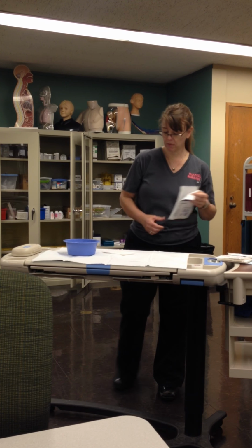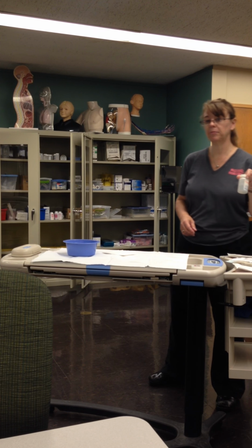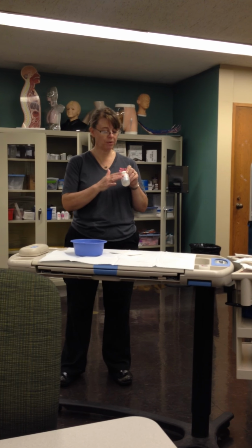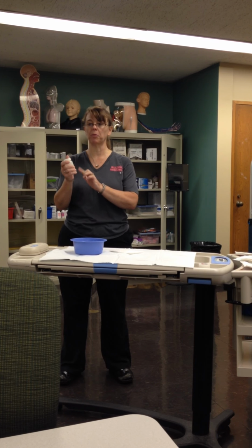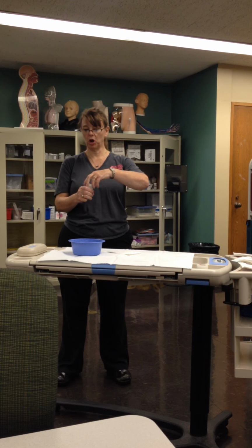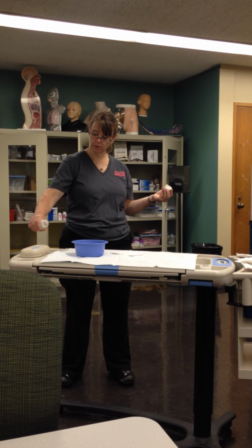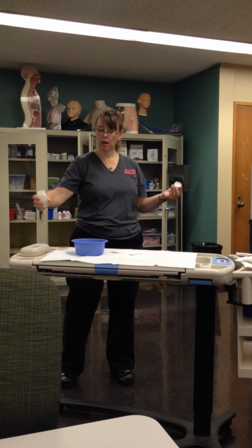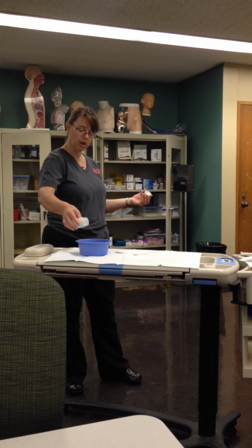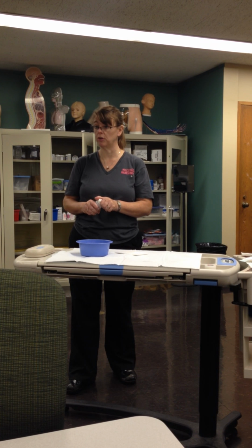So, right there. Then I am going to go ahead and put out my saline, because truthfully, I always forget to put out my saline. So when we open it, we're always going to put our palm over the label so that whatever we're pouring out doesn't run and mess up if we did have a date and a time on here. So I'm going to open it. I would then lip it, so just barely pour. And then I'm going to reach around here to this contaminated area, and I'm going to pour in the bowl. You'd pour enough so that you can get your gauze wet that you're going to do in just a minute.